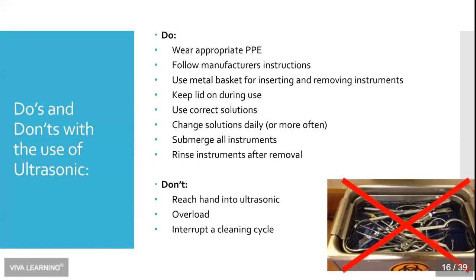Make sure that all instruments are submerged, and that would be underneath the water, and nothing exposed to air. And don't overload your ultrasonic, and never interrupt the cleaning cycle.